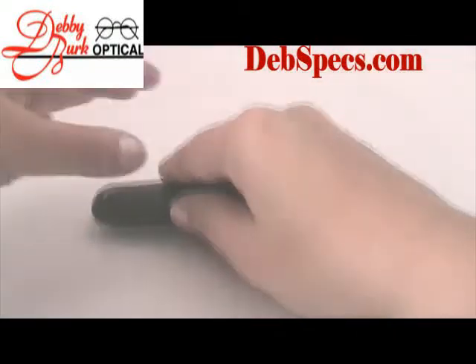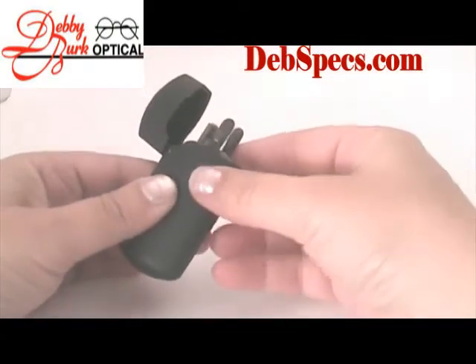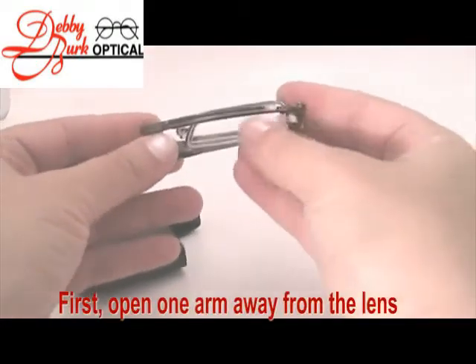Hi, I'm Farrell from Debby Burk Optical, and I'm going to go over folding the mini-opticals. The trick is, if you can remember, the arms fold on the outside of the lenses.